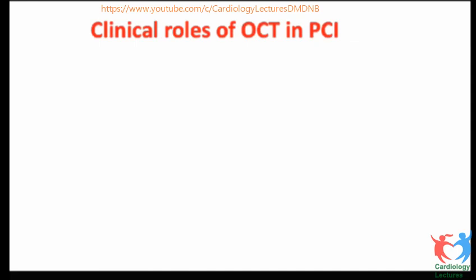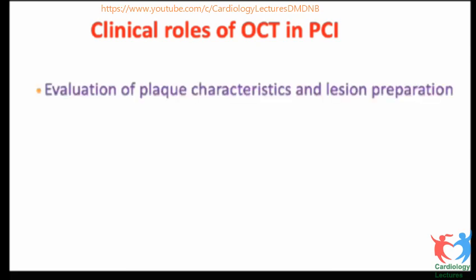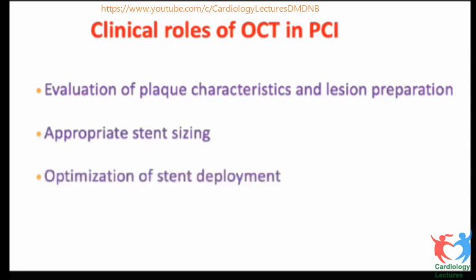Now we move on to how to use this to guide your procedure. Okay, so what are the ways you guide your procedure? One is evaluation of plaque characteristics and lesion preparation. The second is appropriateness of stent sizing. The third one is optimization of stent deployment. And the fourth one is evaluation of device failure.